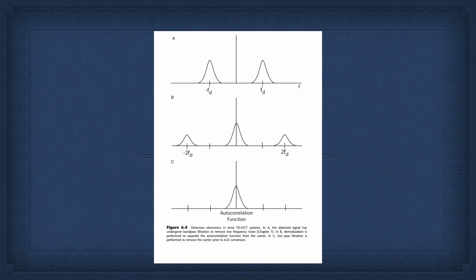And that logging is very important before we go to A to D conversion, because let's say our A to D conversion is at best 80 decibels, but our original signal is 105 decibels. So by logging it, we can get it to the point where our A to D converter can convert the whole signal. But SS-OCT sends the whole raw signal to a computer.